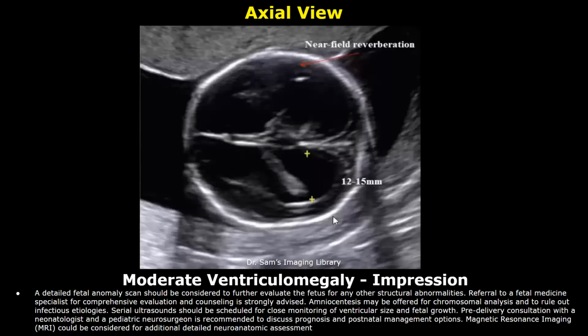Pre-delivery consultation with a neonatologist and a pediatric neurosurgeon is recommended to discuss prognosis and postnatal management options. MRI could be considered for additional detailed neuroanatomic assessment.